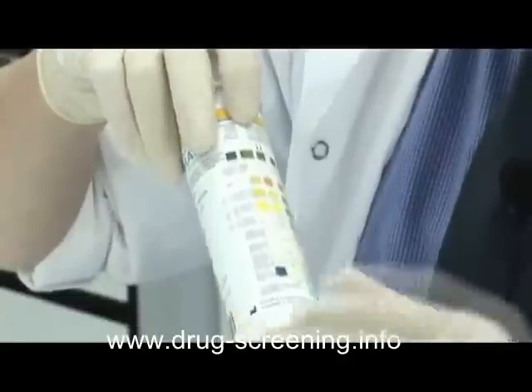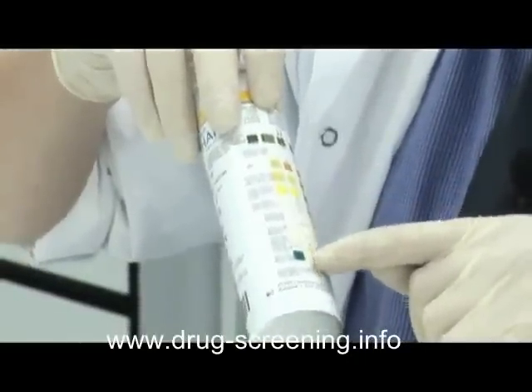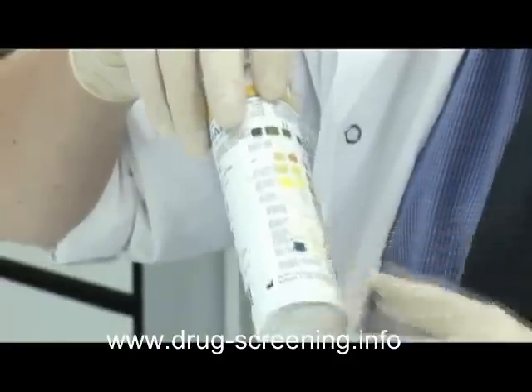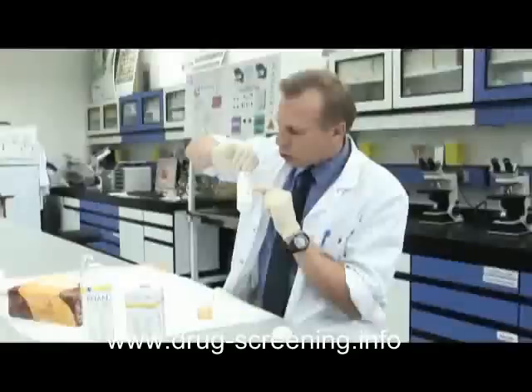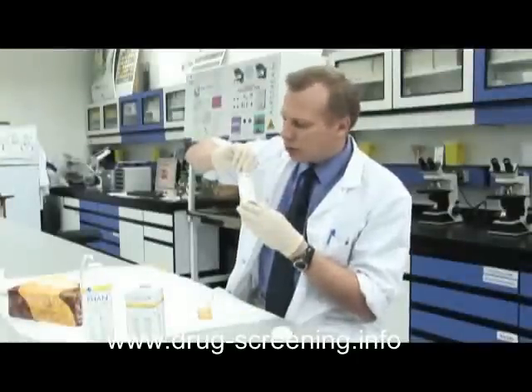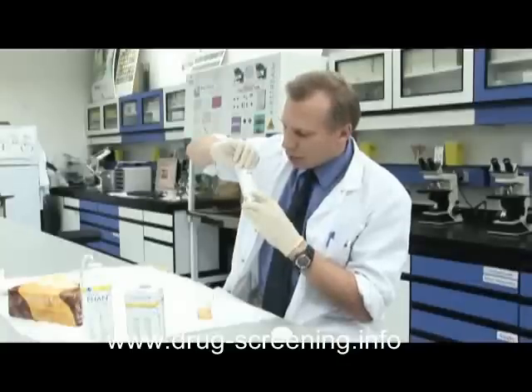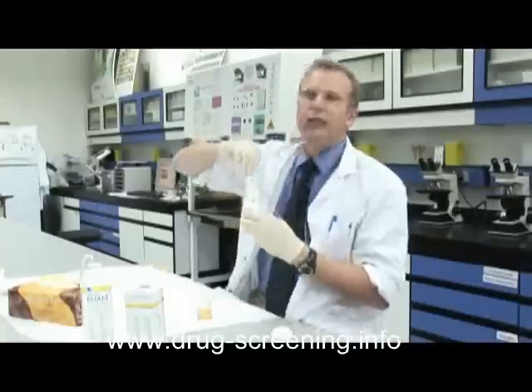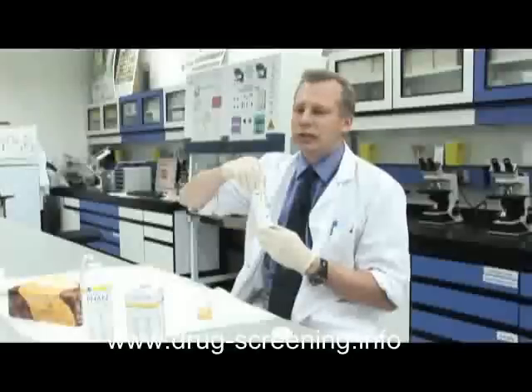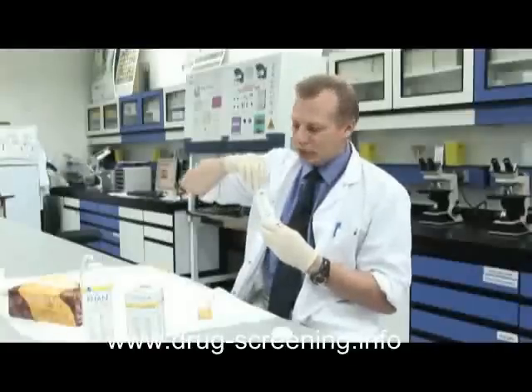Looking at the other squares, I think everything else is normal. That's a nice green, that's pale — that's a normal pH for urine. Glucose is normal. Ketones are normal. And we have other tests: urobilinogen and bilirubin, which are used for liver function. And leukocytes are normal.